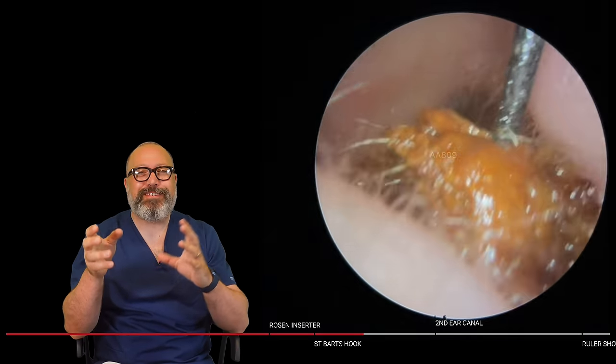Longer plug in this one, not as blocked in fairness. There's a bit of a gap at the top here, but this is quite a long plug. We've got that layer of skin, you can see me just working on there. So let's get rid of that first of all. Oh, we're still going. There we are, almost a ribbon there, guys. So you can see there was this long strip of skin that's gone in there.